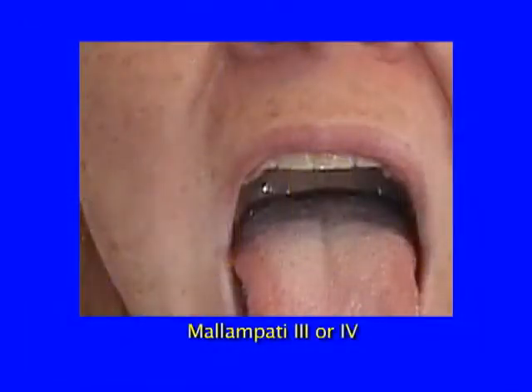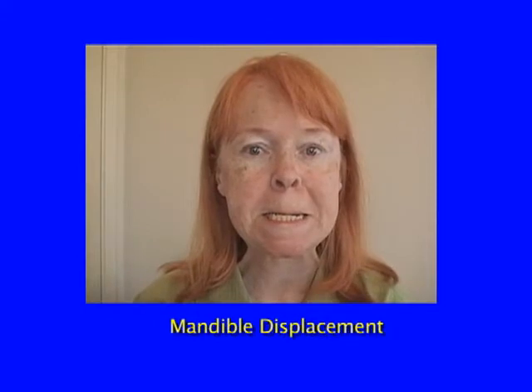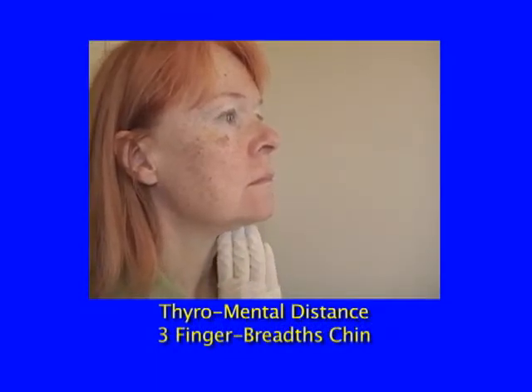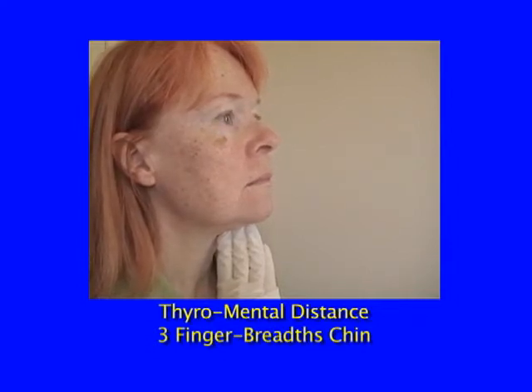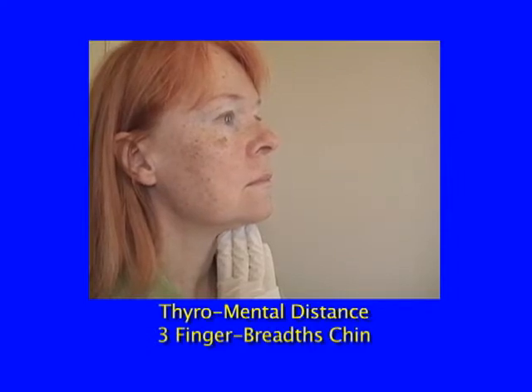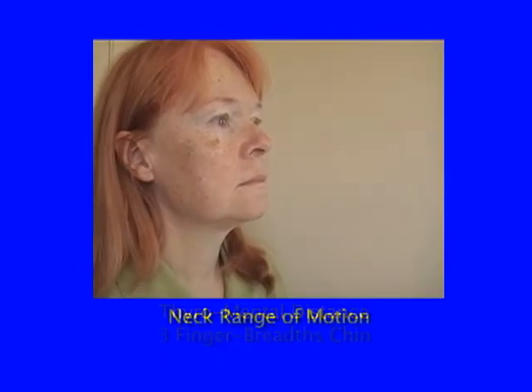Visualization of the larynx can be difficult in these patients because it implies difficulty in displacing the tissue forward with the blade. Have your patient slide their lower jaw over their upper. Inability to do so may make it hard to displace the jaw. If the distance inside the mandible to the hyoid bone is less than 3 finger breadths, then the larynx is positioned higher in the neck than average. This can also make intubation more challenging because there is less space to displace the tongue and other tissues forward.